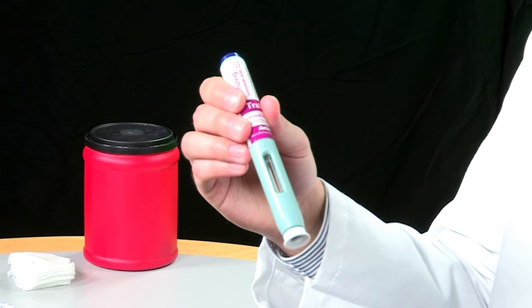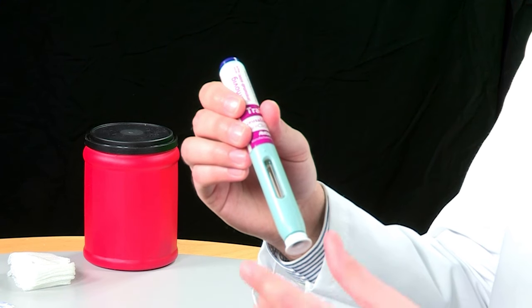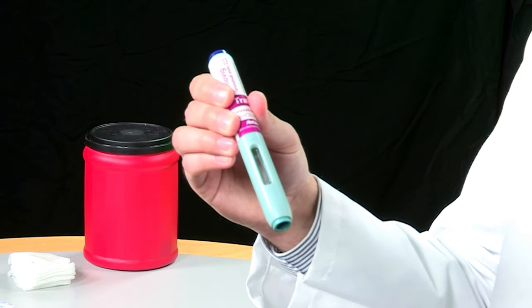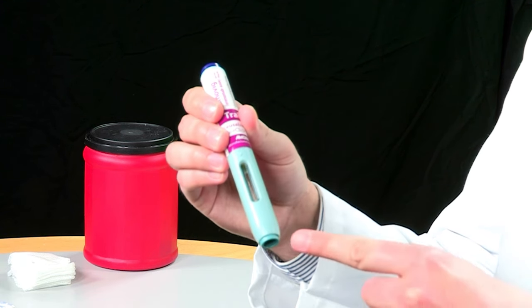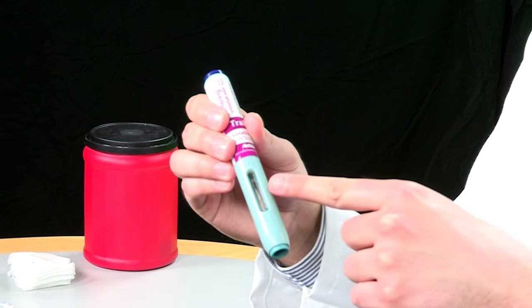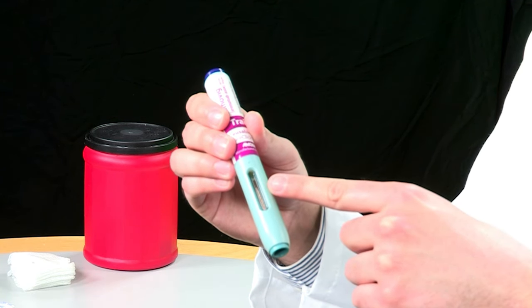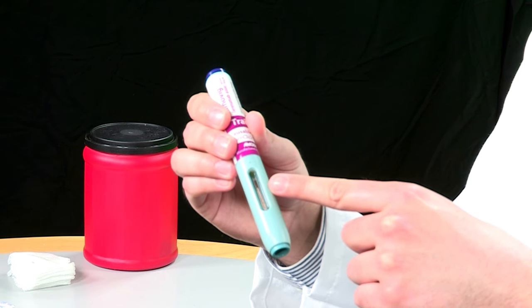The Erenumab autoinjector has several components. The white cap will need to be taken off before you start your injection. The green safety guard has the needle nested inside it. The window shows the clear liquid medication, and the window will turn from clear to yellow once you have injected all the medication.